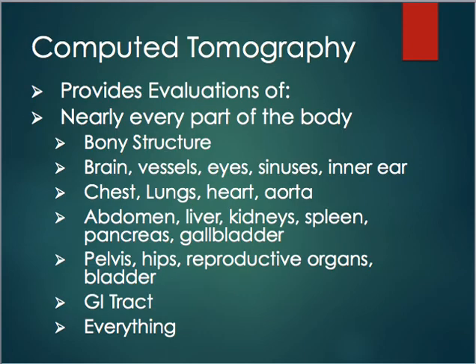CT can provide evaluation of nearly every part of our body. Bony structure, the brain, blood vessels, our eyes, our sinuses, and our inner ear. There's a lot of bones inside of the inner ear, and they're very small and tiny, and it's hard to see. But with CT, it can go through those slices, and you're much better able to visualize it.